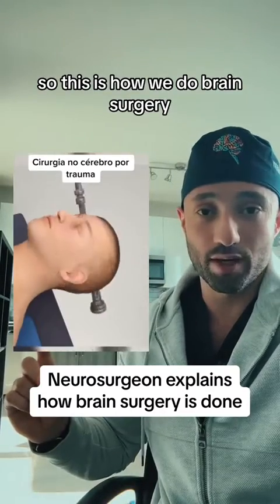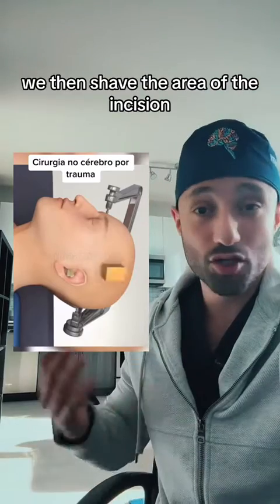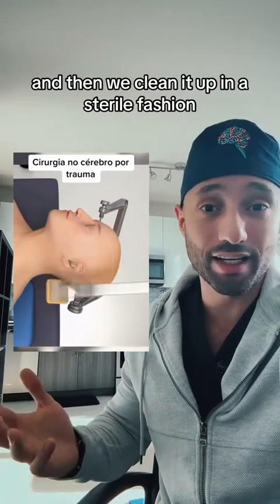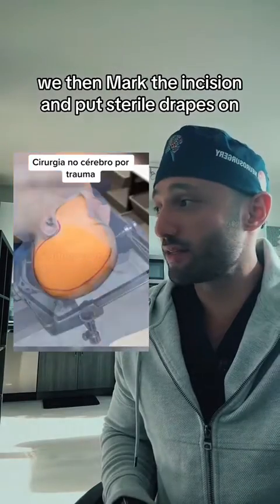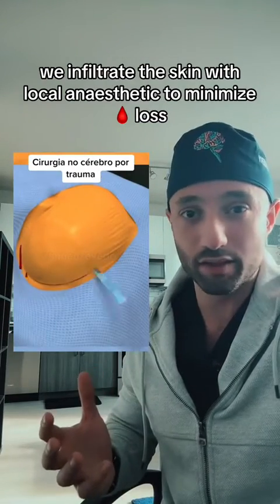So this is how we do brain surgery. We position the patient and place them in this skull clamp that keeps their head in place. We then shave the area of the incision and clean it up in a sterile fashion. We then mark the incision and put sterile drapes on. We infiltrate the skin with local anesthetic to minimize blood loss.